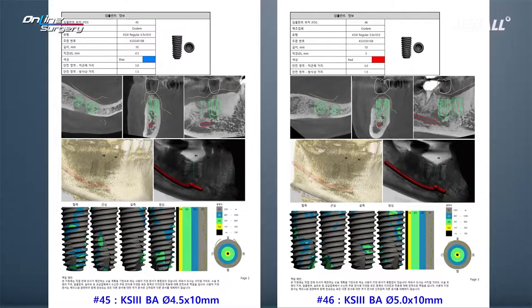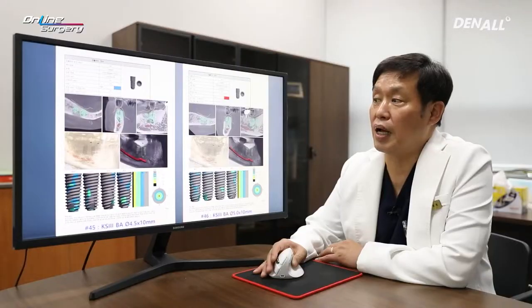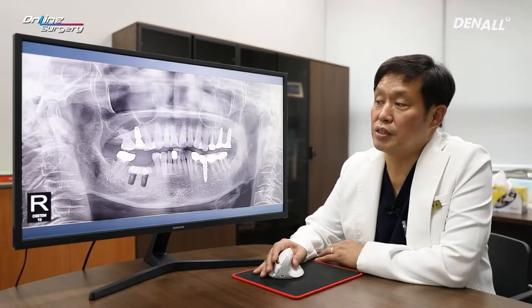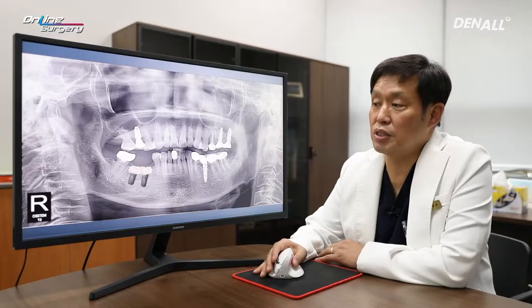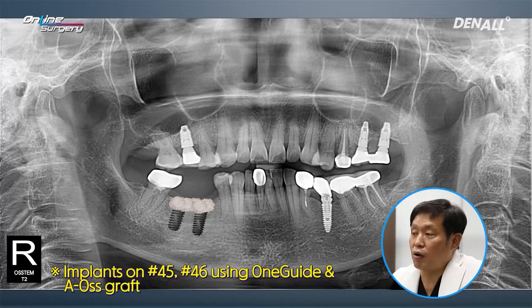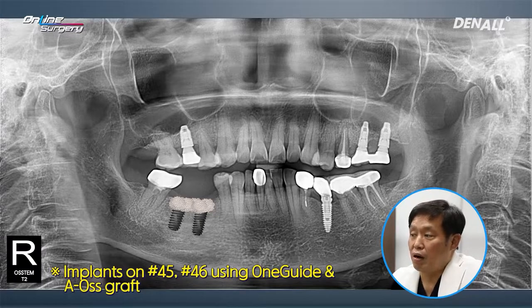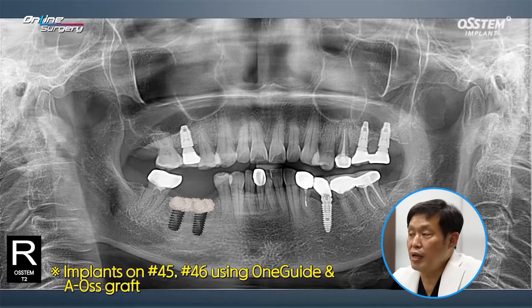In number 45, KS3 4.5 by 10 mm and in number 46, KS3BA surface 5.0 by 10 mm implants were planned. As shown on the CT, buccal bone is not fully consolidated. Therefore, OneGuide will be used to place the implants, and afterward, AOS graft or bovine bone graft will be done on top.